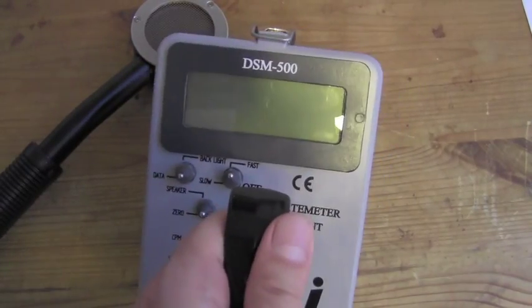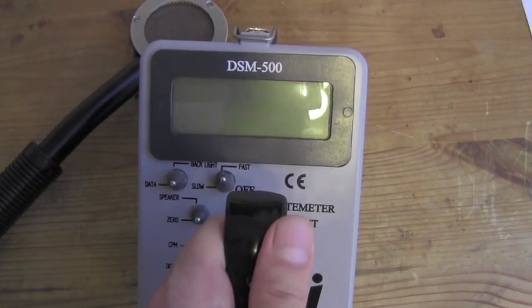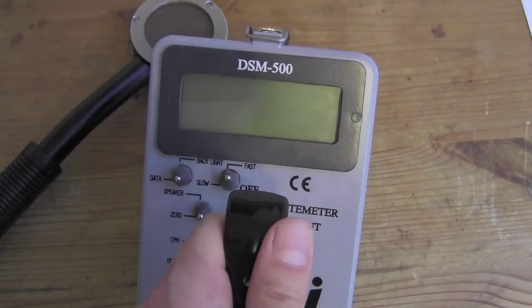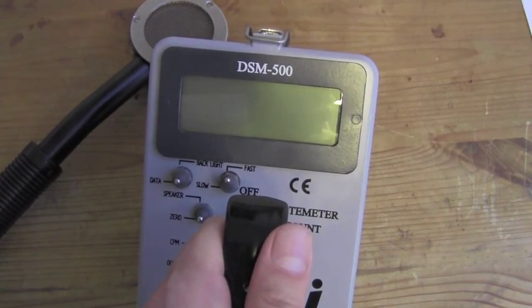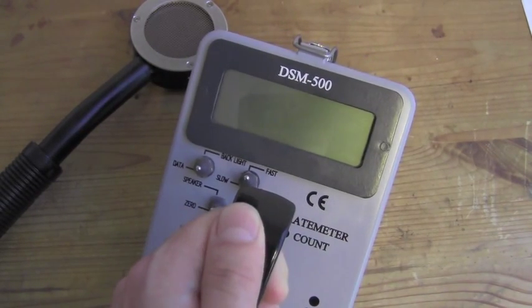This is the DSM-500 Digital Survey Meter. It is the newest generation of our radiation survey meters.